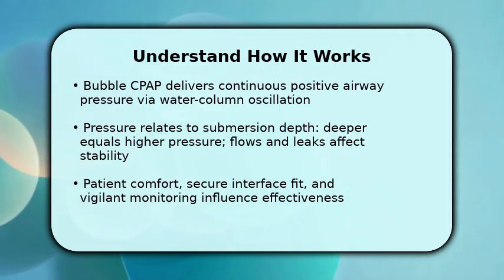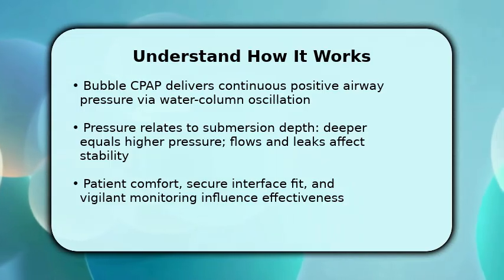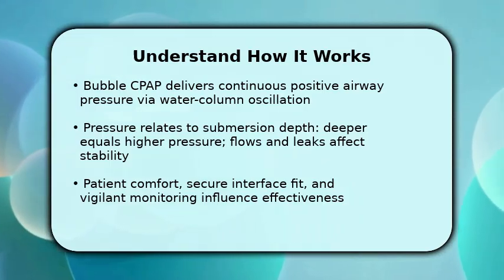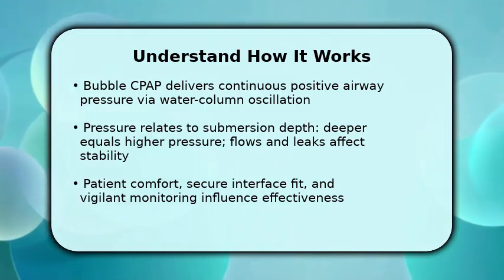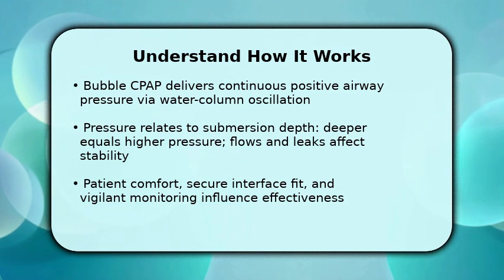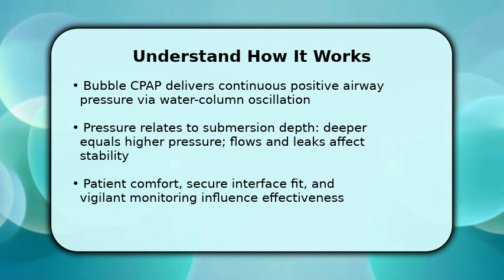Make sure you appreciate how tubing leaks, flow settings, and interface fit influence delivered pressure and patient comfort. You should be able to describe these relationships to the supervising clinician. If you're learning, practice under direct supervision and use simulation training to build competence safely.